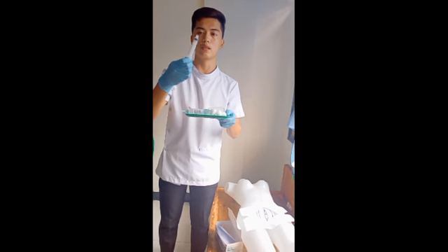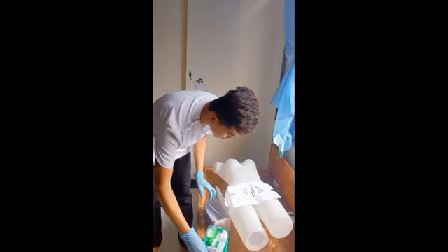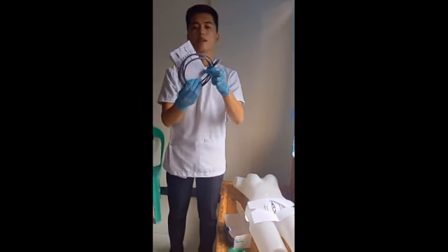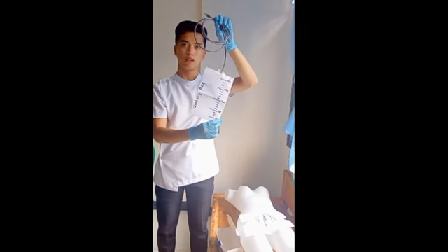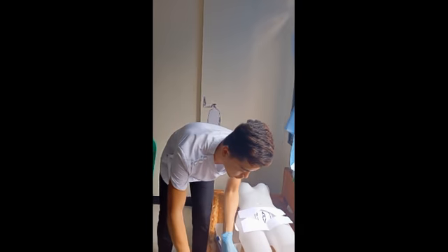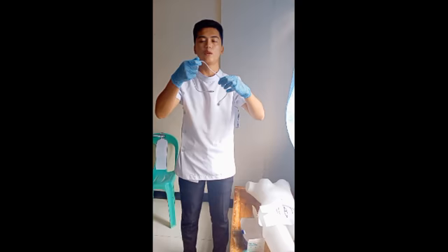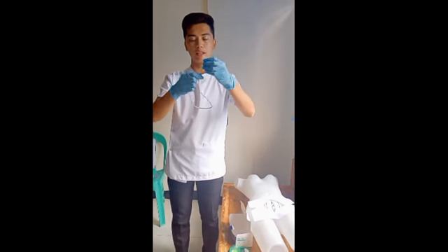Then this is the 10 cc syringe that we need. The next is this is the urinary bag, and this is the important equipment that we need.